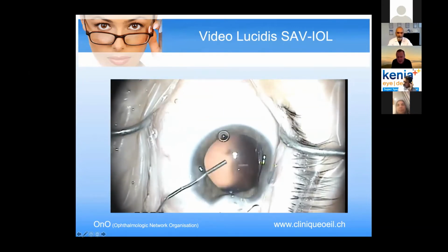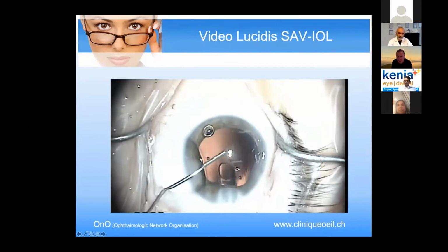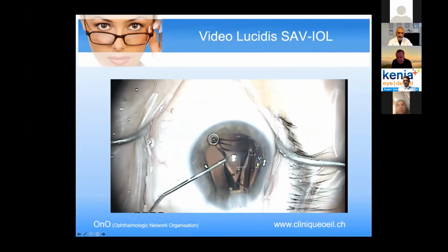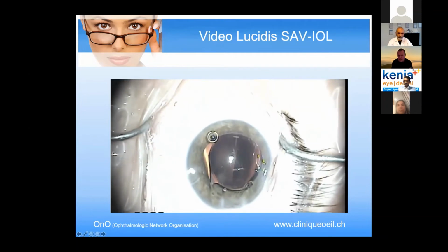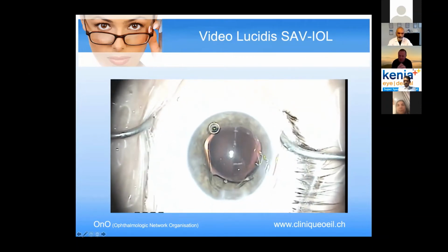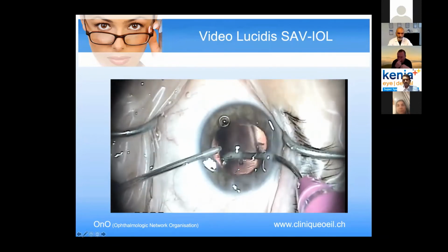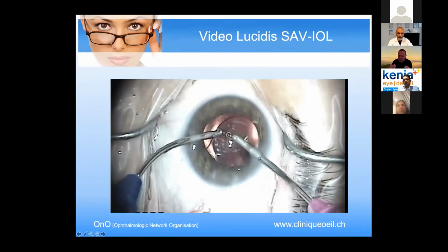And then I introduce the Lucidis inside the chamber. You see, it's 2.2 at this time. For the beginner, you have to not push too much on the lens because it's a strong lens, and you can have some zonulolysis at the beginning. It's something that you have to respect with this lens.